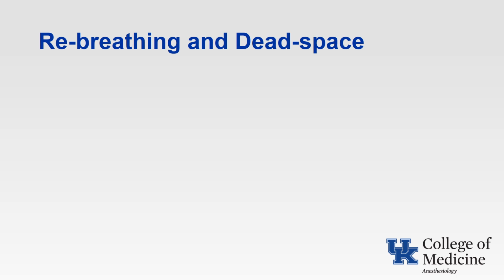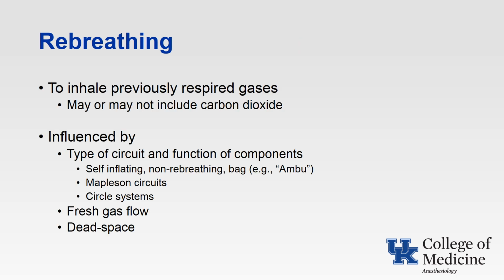Another topic is rebreathing and dead space. Rebreathing refers to inhaling previously expired gases. This may or may not include carbon dioxide. Of course, if you have a CO2 absorber in the system and properly functioning valves, there should be no rebreathing of CO2, but there may be rebreathing of other exhaled gases.